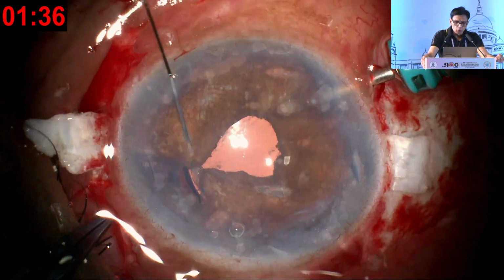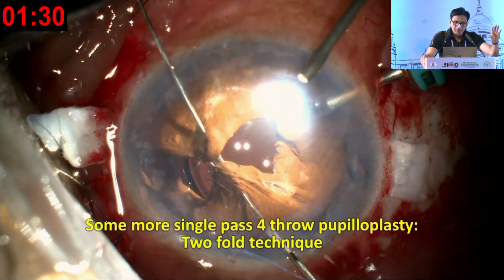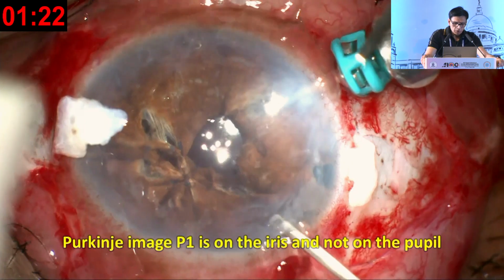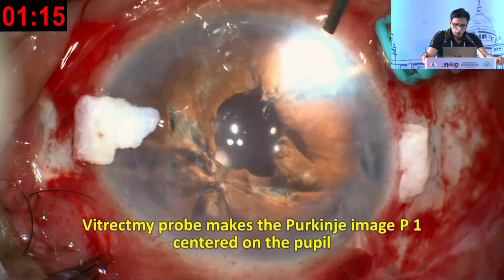I now can do some more 4-throw pupiloplasty, making the pupil much better. So this is a two-fold technique where I've combined the trocar assisted with the 4-throw pupiloplasty, and you can see how the iris is now looking much better. Purkinje image is bang centered now. See that inverted image, that is the P4 which you are seeing on the top.